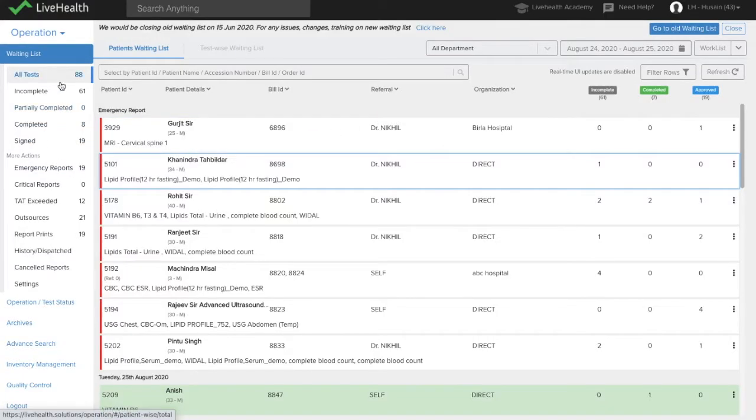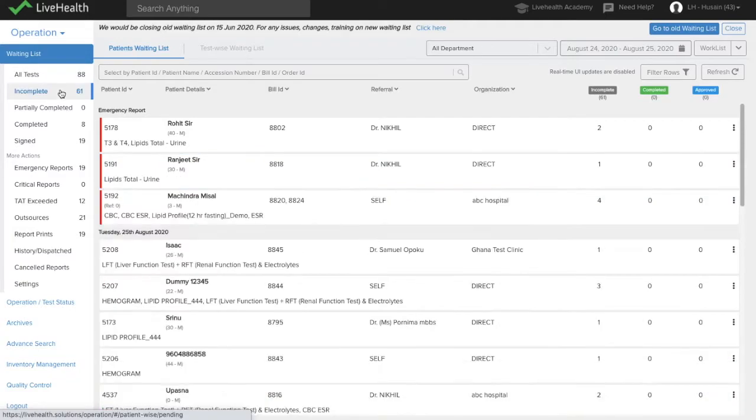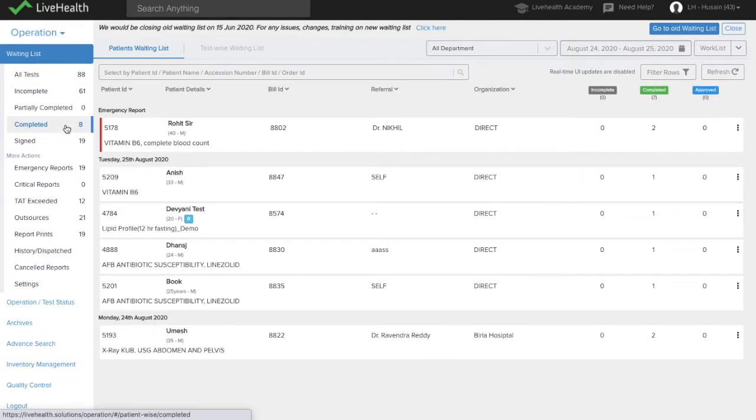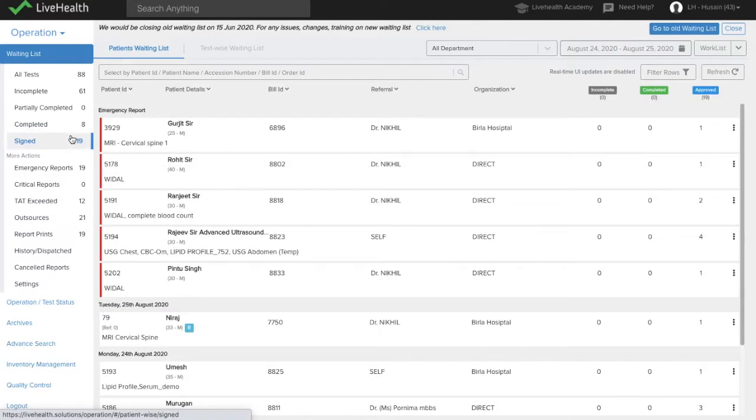You can also filter by status from the left-hand side, which also gives a count. So there are 61 reports which are incomplete right now. There are eight reports that are completed. That means they are yet to be approved. And there are 19 reports which are already authorized, but not yet submitted.